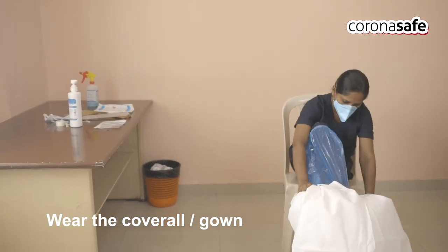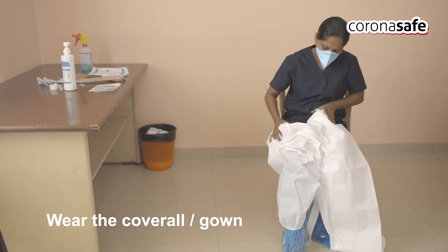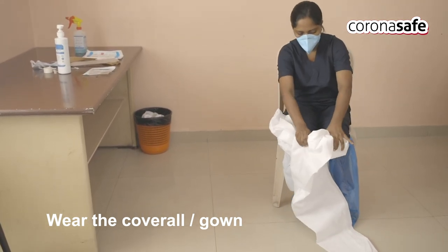Next, wear the coverall or gown. Hold the coverall by securing the sleeves in both hands. Sit facing to the front and put the legs in first, then proceed to the trunk, hands, and finally the hood.